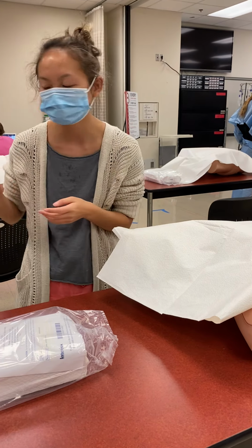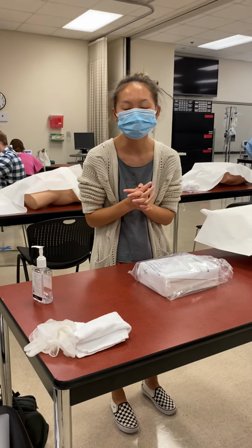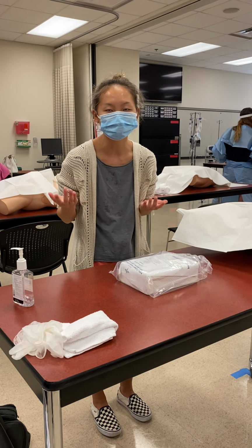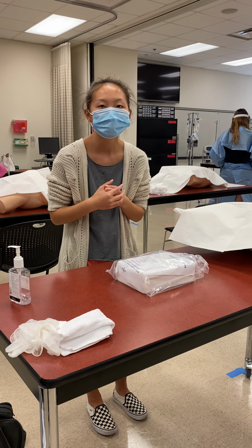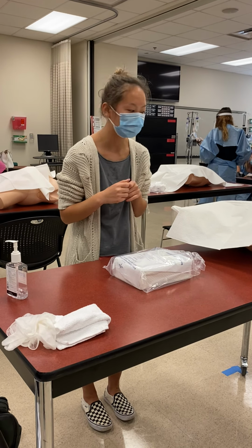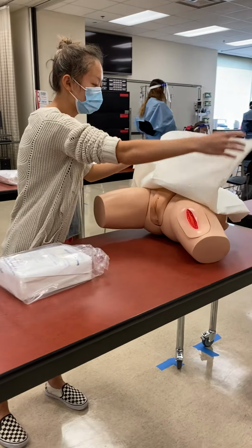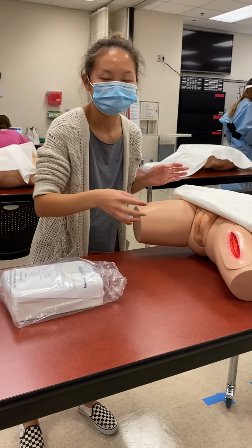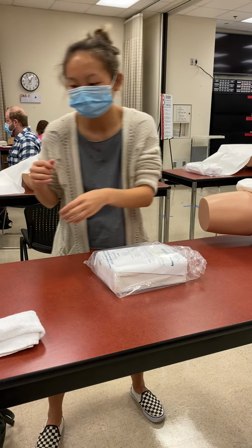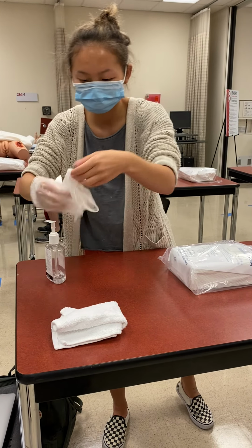So before I start this procedure, I want to provide patient privacy, so I would close the blinds and then close the door, and then if their bed was too low, I would want to raise it up so I'm not bending down too far and strain my back. So first I'm going to be performing pericare, so I want to tuck back the patient's linens, and then I would ask him or her to bend their legs so they're more at an angle. And so I want to get on our gloves for today.